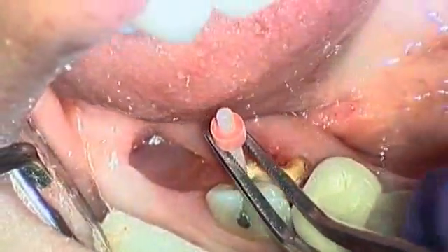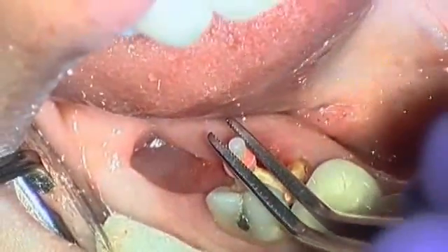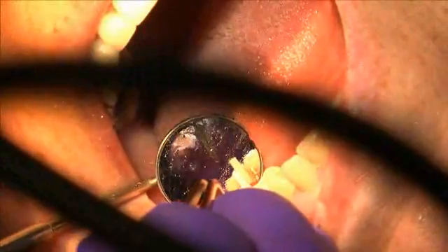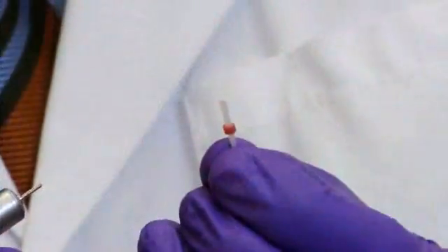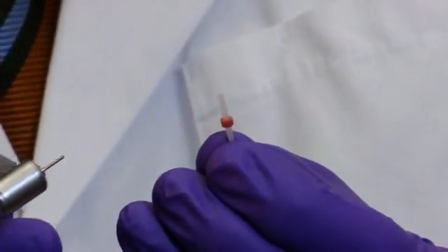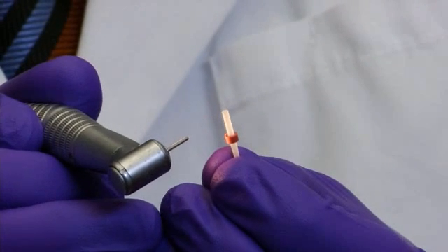Insert the post to check the fit in the prepared canal. You should be able to easily remove the post. Shorten the post to the required length using a diamond disc and suction system.